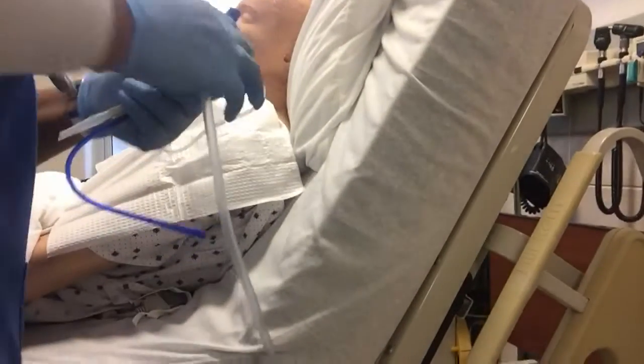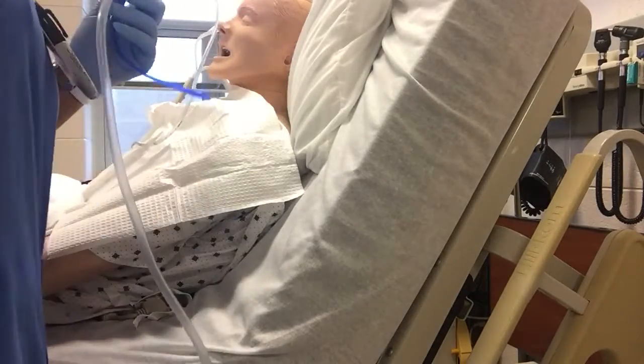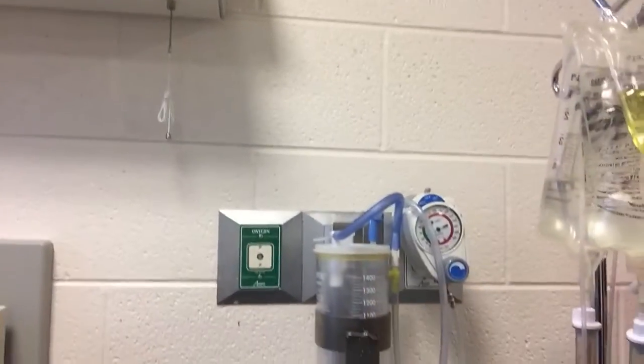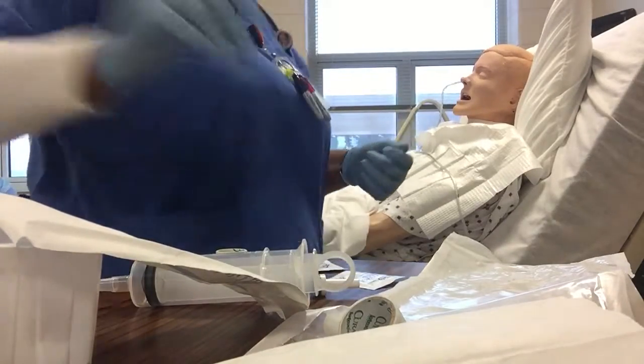And it's on. We'll connect it, showing that my line is actually going up and it is connected to the suctioning on the wall. So as you see, intermittent suctioning, you can hear it going on and going off. And you will set it between 80 and 120. Once that is done, the pH has been checked and it's showing that it's in proper place.